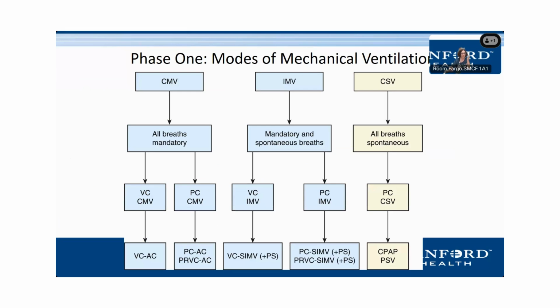We do have smart ventilators out there that use a combination. They're dual modes where we can tell it, I want you to use pressure ventilation, but I want you to target a tidal volume for me. And the computer algorithm in the ventilator can adjust the pressure to get the target tidal volume. And on our Hamiltons that we readily use around here, it is called APV, Adaptive Pressure Ventilation Mode. That is that smart mode that you will use pressure ventilation, but to target a tidal volume.